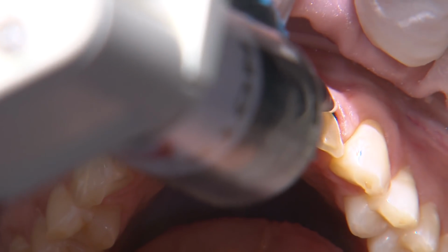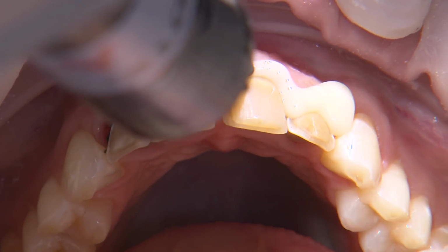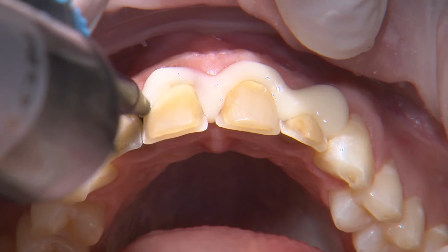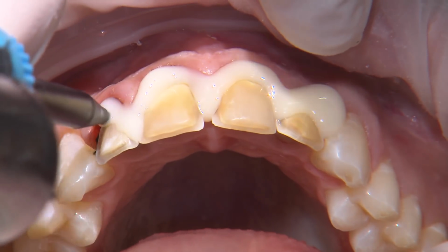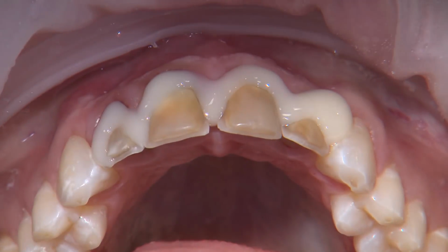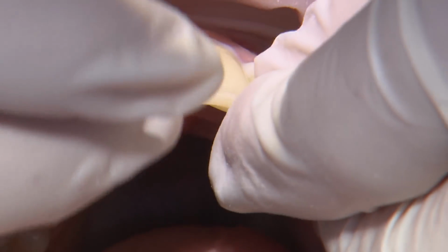Using a technique I picked up from USC Dean Dr. Avishai Sadan, I flowed the material along the margins first, like a light body impression material, and then seat the shells. I found this to help minimize bubbles along these areas. I applied a thin layer of Vaseline to the preps to aid with the removal after they're cured.